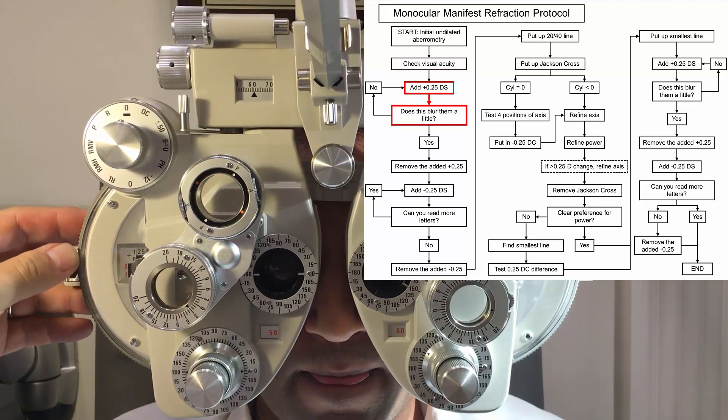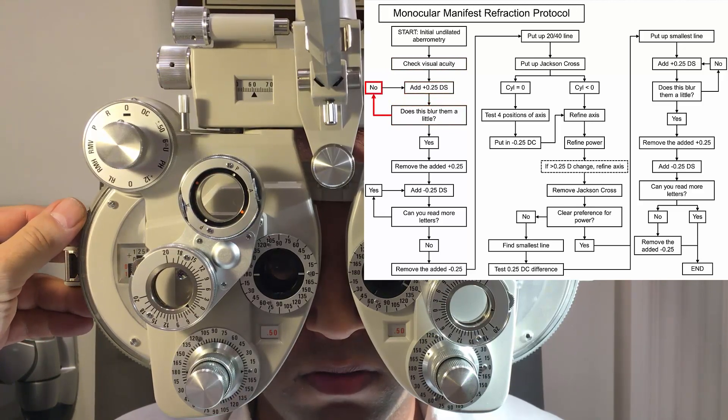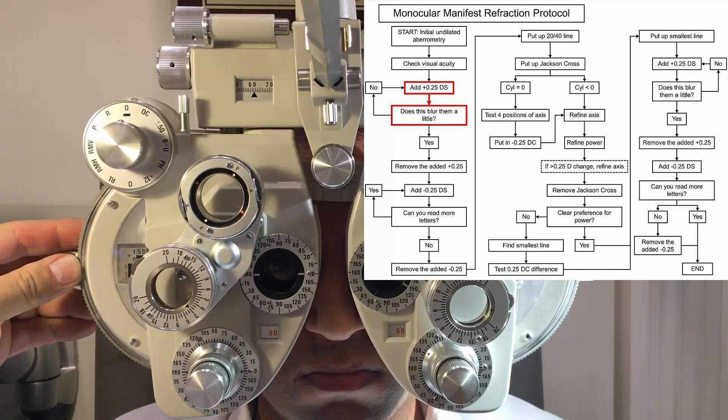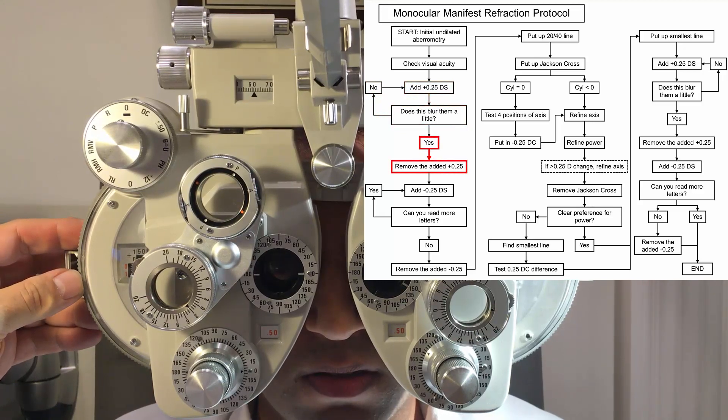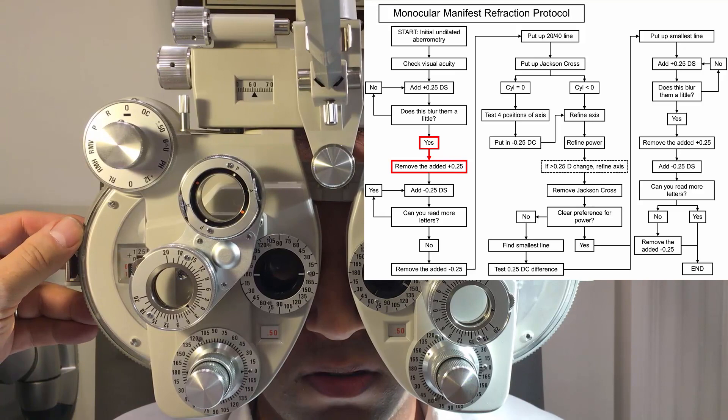Does this blur them a little bit? A little bit. Not really? Does this blur them a little bit if I go to there? Yes. So you can see more letters if I go to here. Yes.